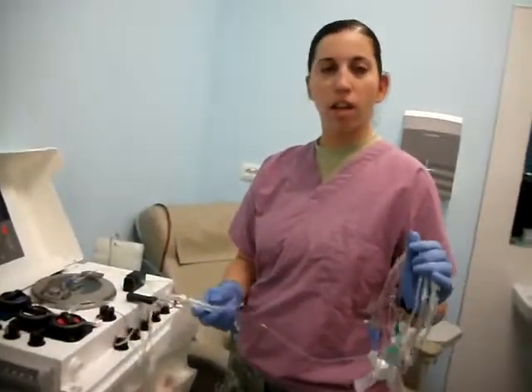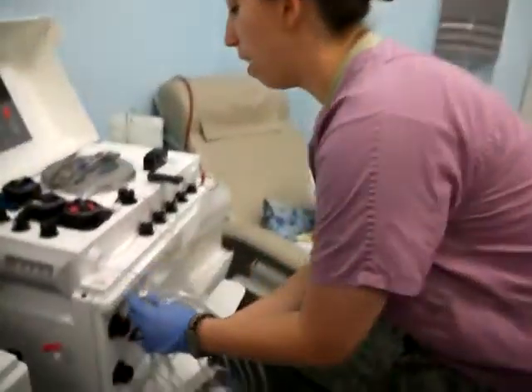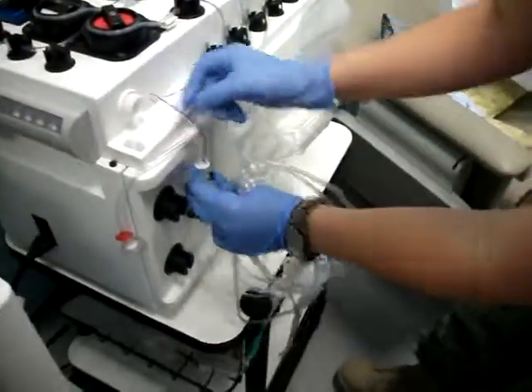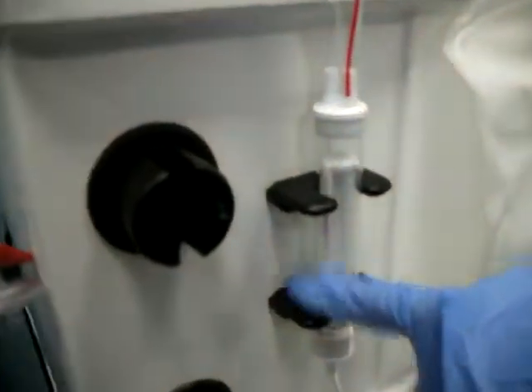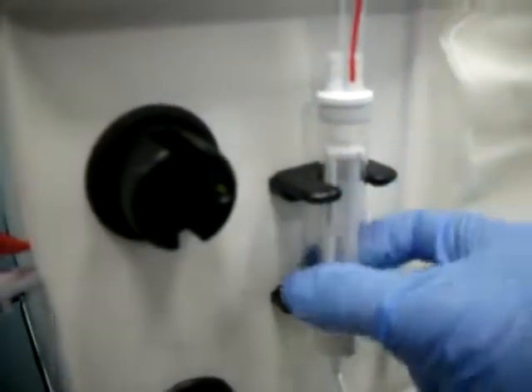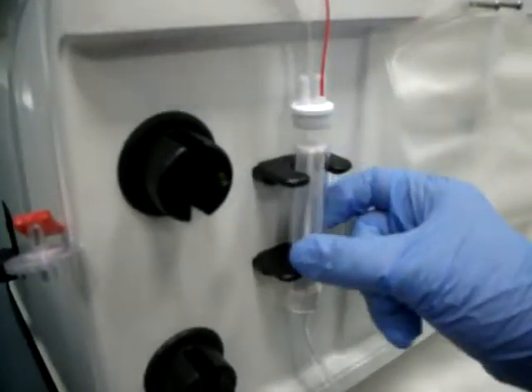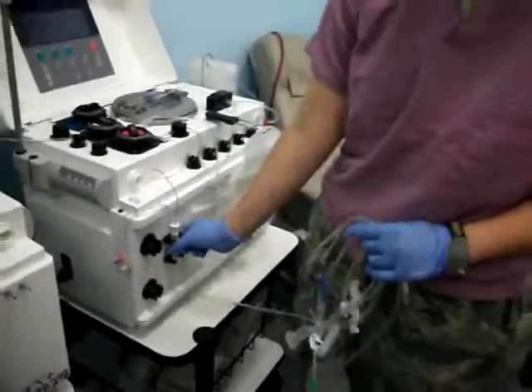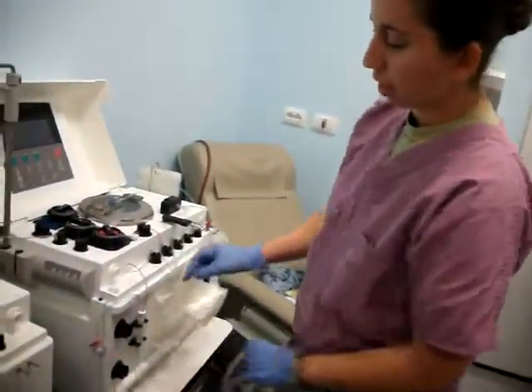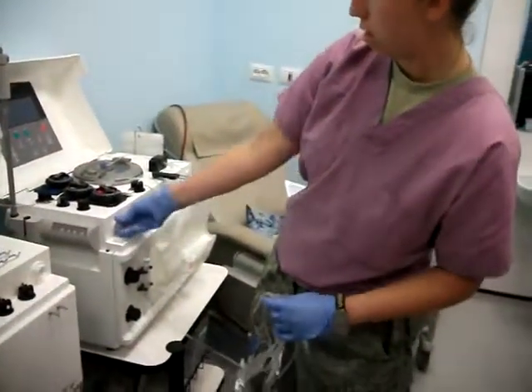Now this next part, there are a couple different ways of doing it. The way I do it is I put this in here first. You want to make sure that the white hard plastic is facing outward — if you have it the other way, it'll fall off and you'll wonder why things aren't going well. So make sure they're facing outwards like that. Go ahead and put the DPM in.